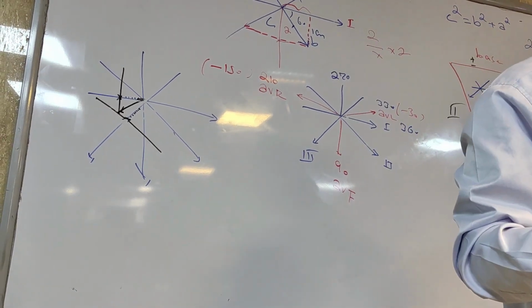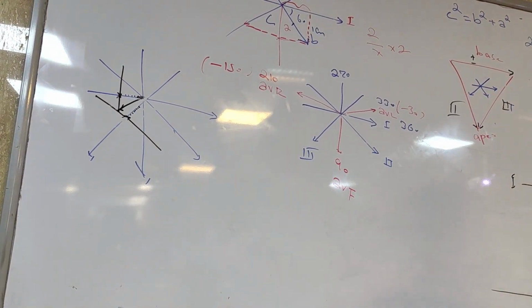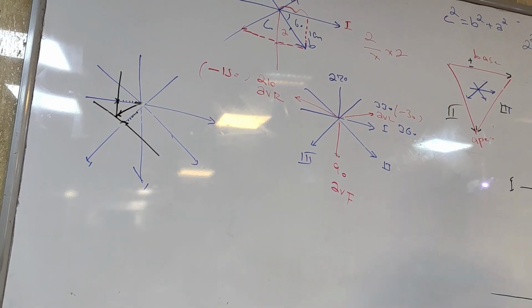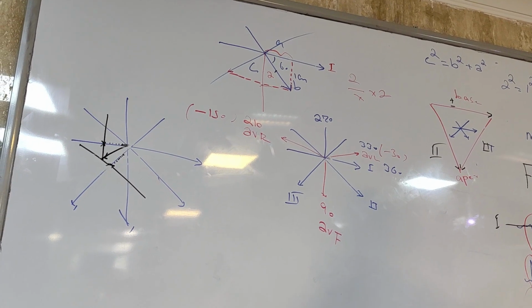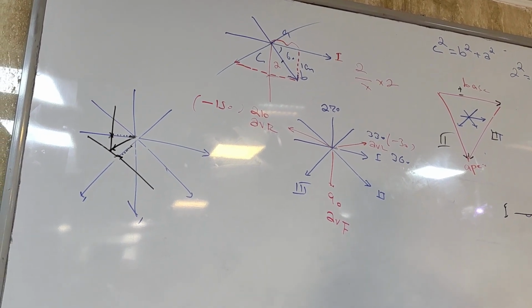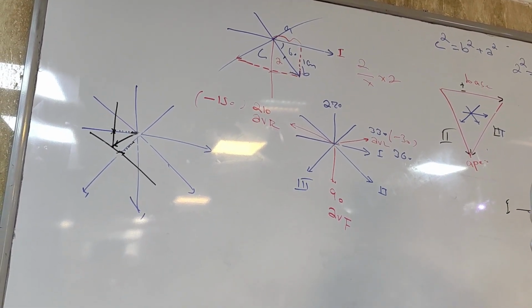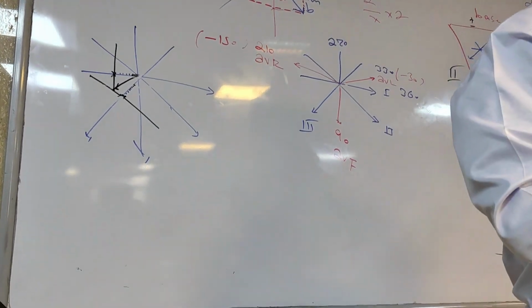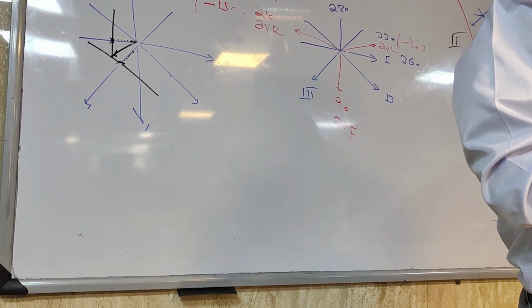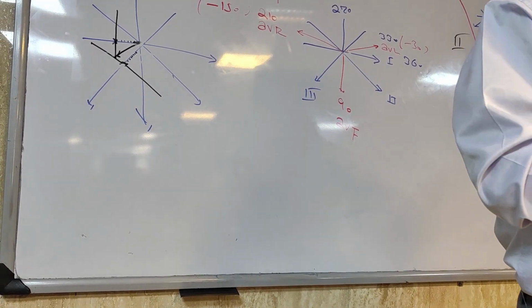So if there is an infarction, then during the TP segment you have voltage changes. It is not a straight line. This is called current of injury.